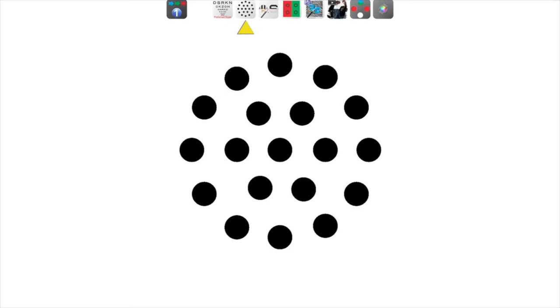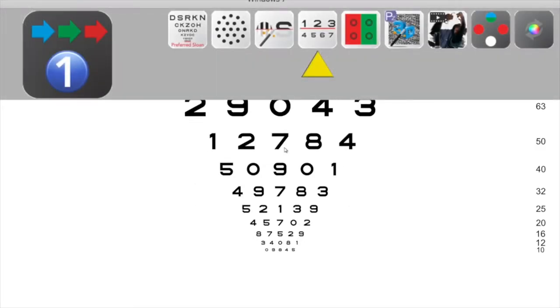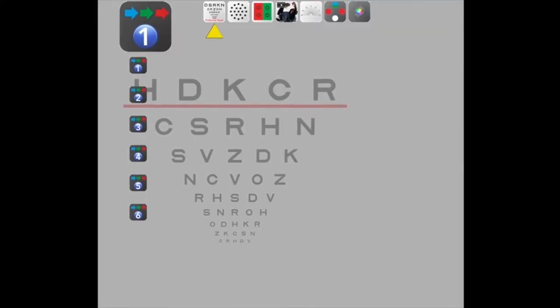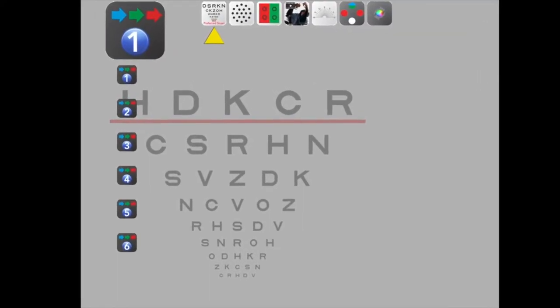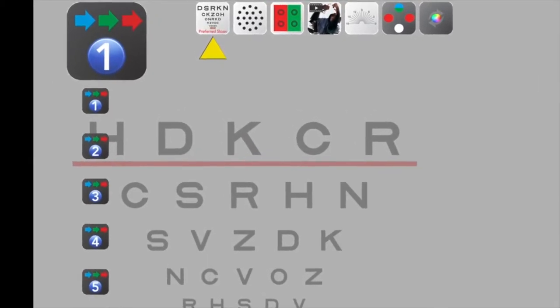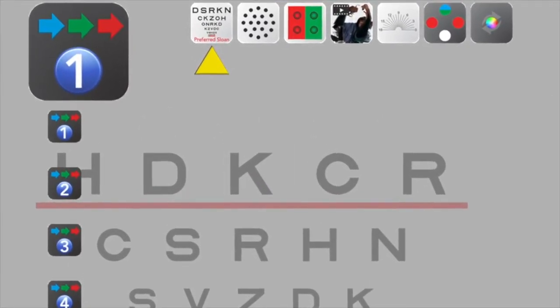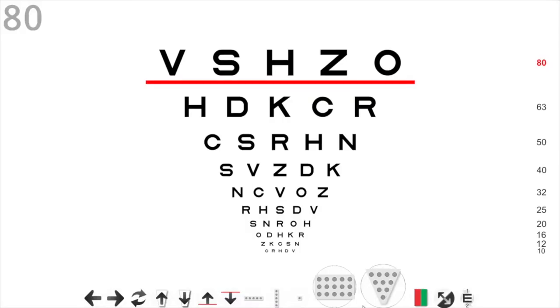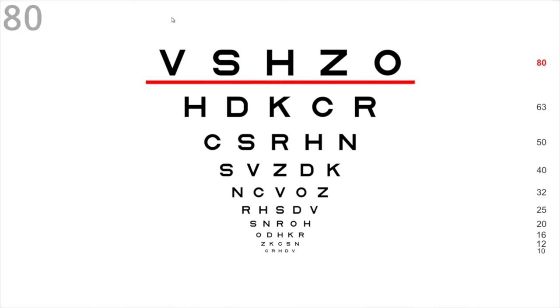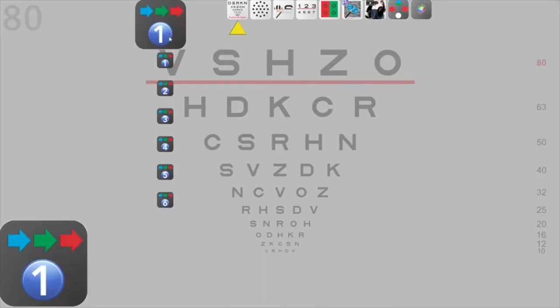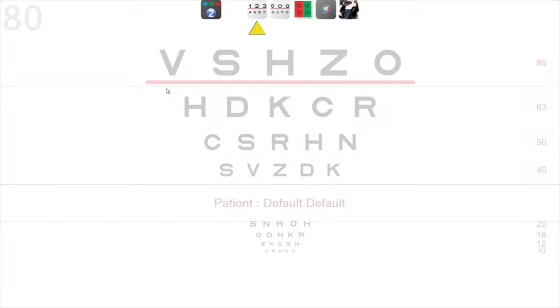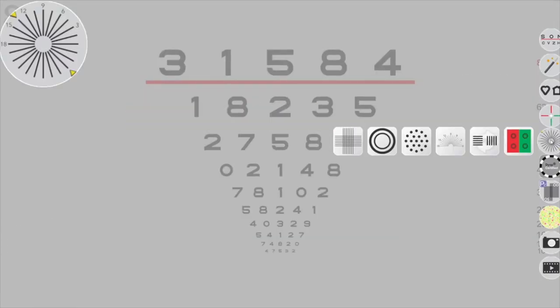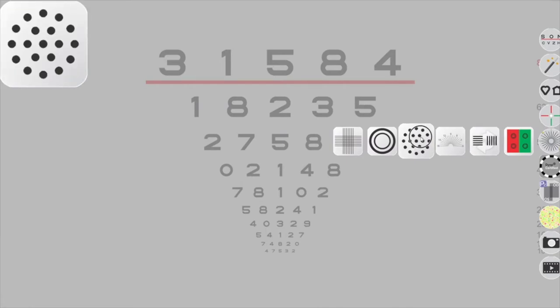You can still randomize the letters or change VA size without losing your current position in the Sequence. The Sequences Dock is positioned at the top of your screen for easy visibility and access. The yellow pointer shows your current position. Setting up the Sequences is easy with drag-and-drop simplicity. Let's add the showerhead to Sequence 2: first, select Sequence 2, then drag a chart from the test library on the right-hand side menu and drop it into the Sequence in the position you require.